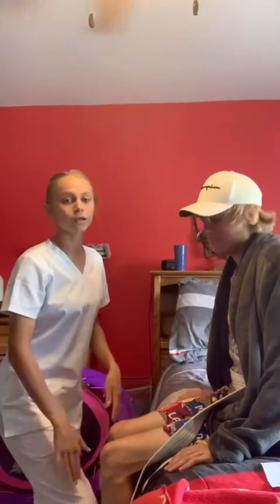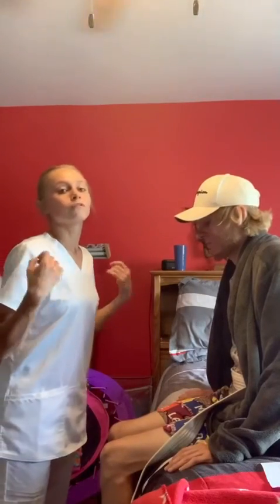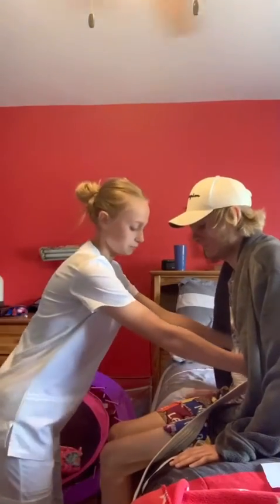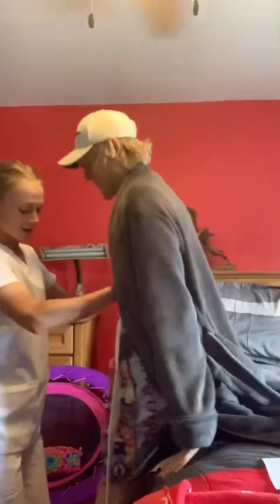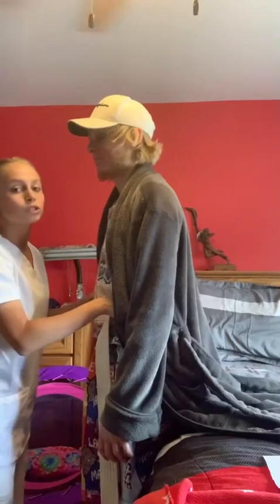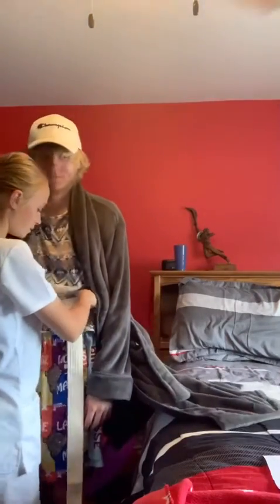Okay. And also our knees are up against each other, and so are our feet, just to add more support for helping. So on the count of 3, 1, 2, 3. Okay, so now after this, I am just going to slowly pivot and help turn my resident.